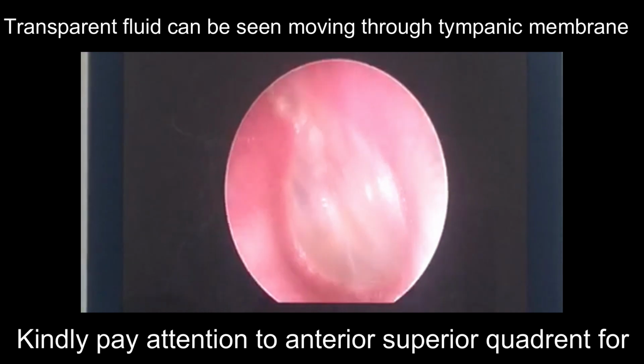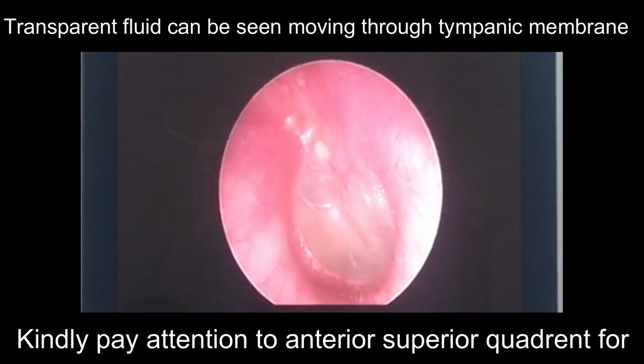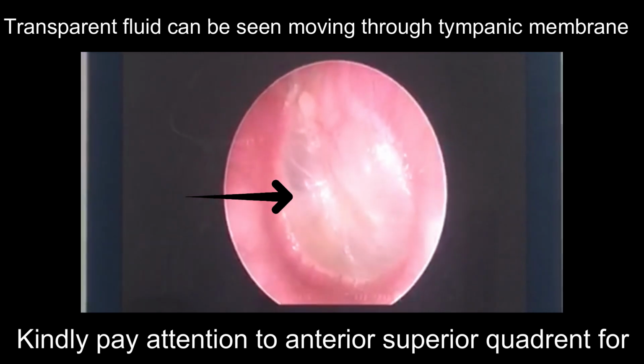Show a case of left chronic otitic retraction and perforation following serous otitis. It's a case of a 60-year-old male patient with a history of 10 years of left moderate progressive hearing loss.